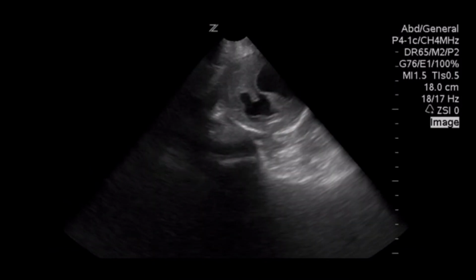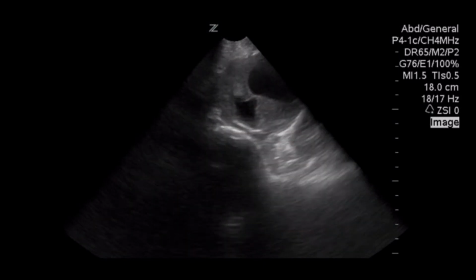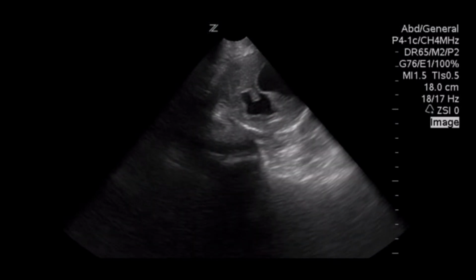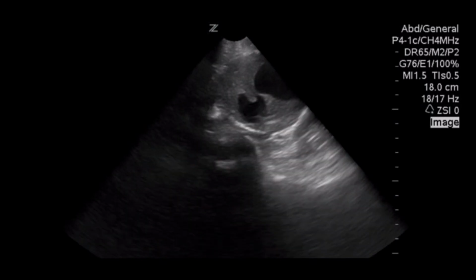Last up, we have a pseudoaneurysm of the aorta. This is when, within an aneurysm, the tunica intima and the tunica media are usually violated. However, the tunica adventitia is preserved. These are also at high risk for rupture. Now let's review by looking at a real exam.